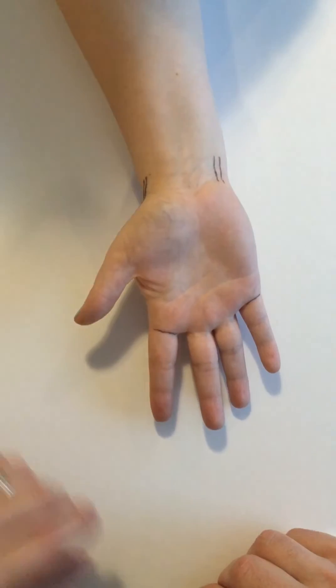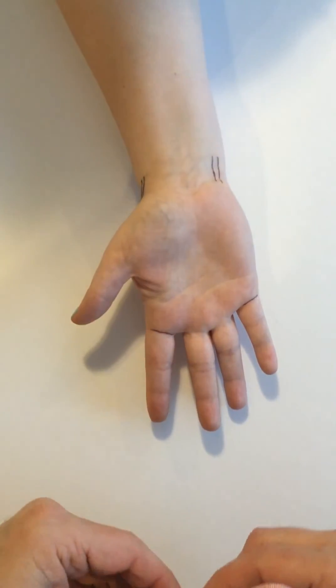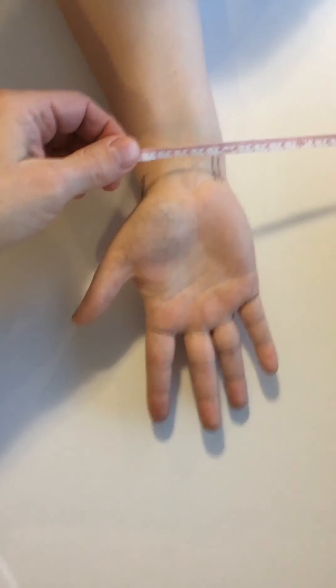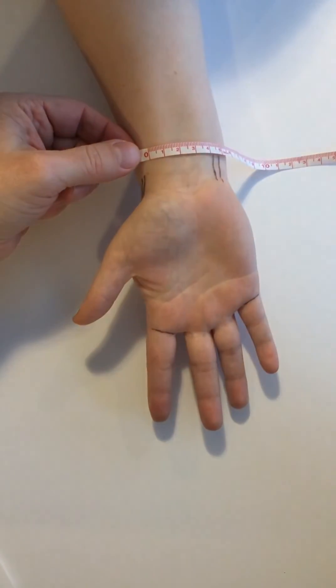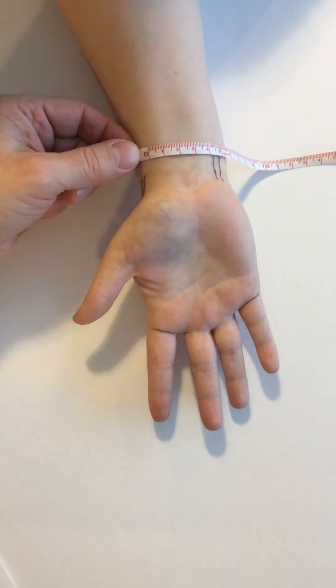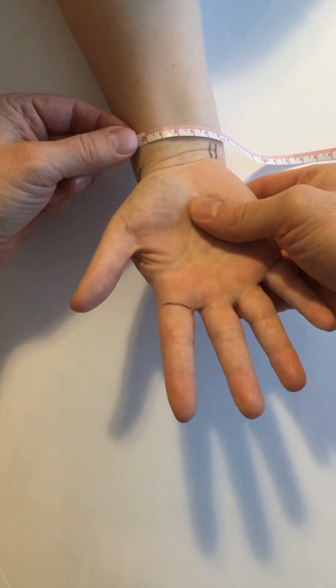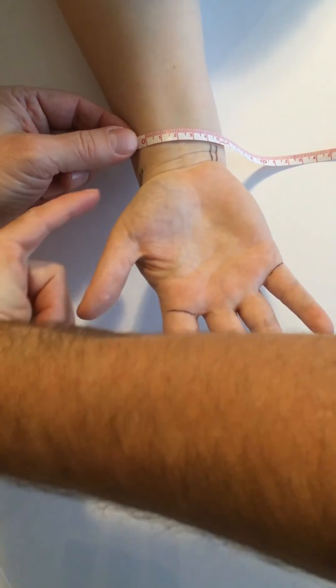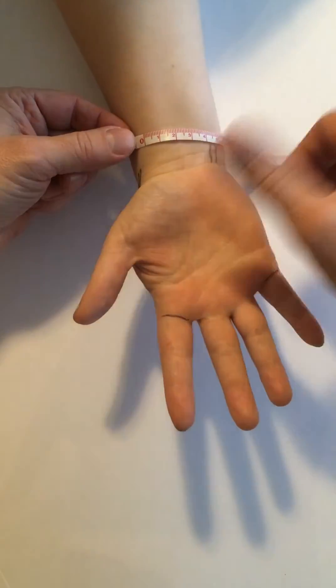So what we'll do here is we're going to start at the radial volar aspect of the wrist with our measuring tape and we want to align the distal edge of the measuring tape with the distal wrist crease. The distal wrist crease is defined as the wrist crease that crosses both abductor pollicis longus and flexor carpi ulnaris.